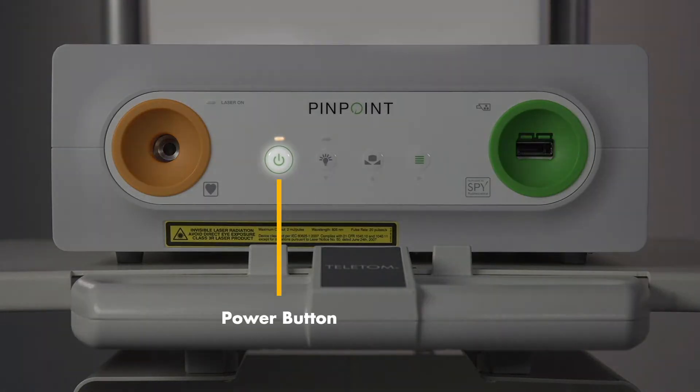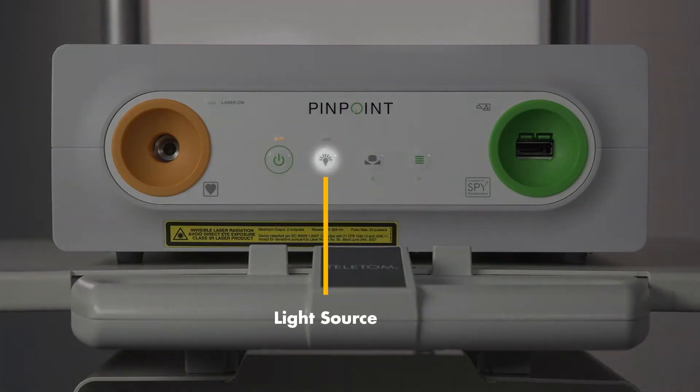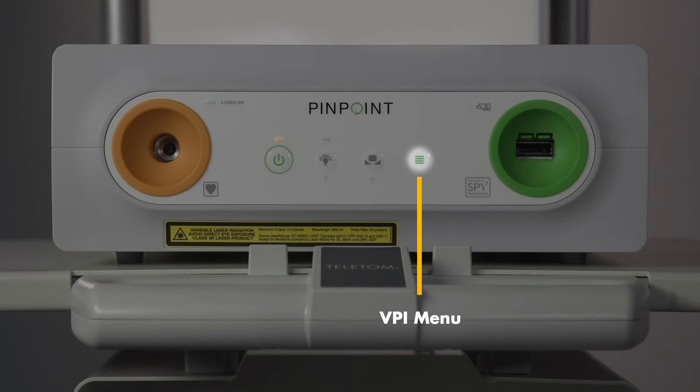Here's the power button with the indicator light above it. This button turns on the light source. Use this button to white balance, and this button brings up the VPI menu.